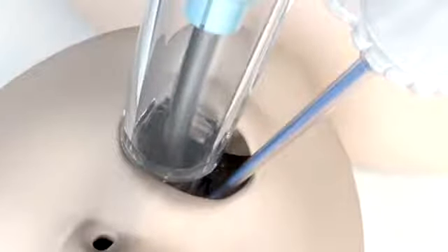The endotracheal tube, which in this case is shaped by a malleable stylet to complement the unique blade angulation of the GlideScope video laryngoscope, is inserted adjacent to the blade under direct vision until the distal tip of the tube is very near the distal tip of the laryngoscope. This relationship is quickly and easily achieved, and only then should you return to looking at the video monitor.